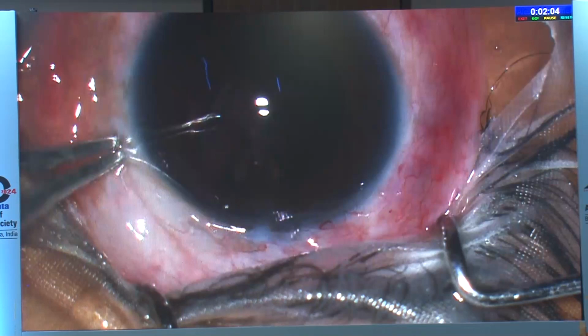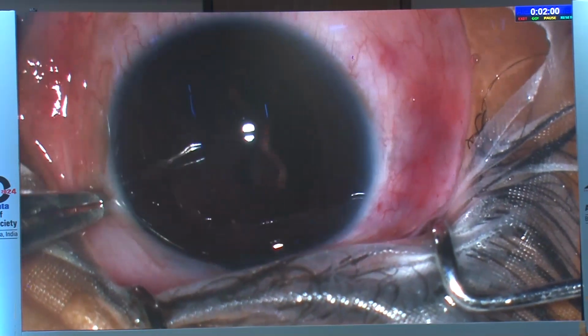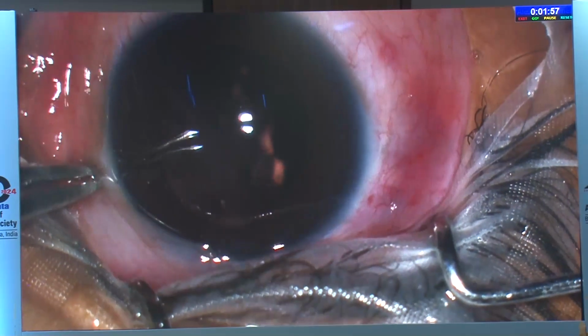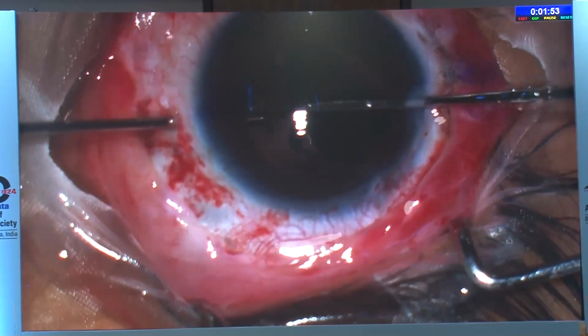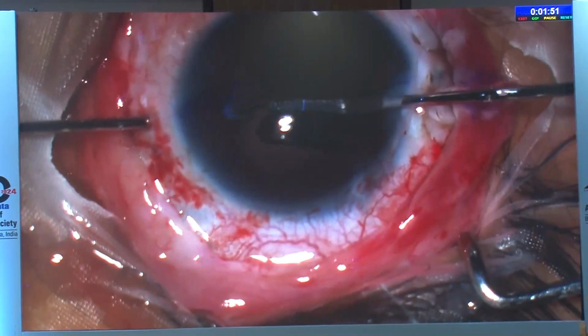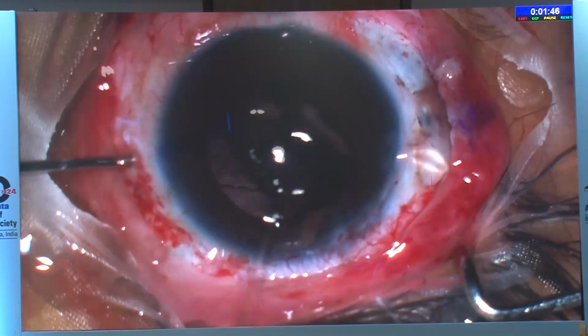So in this second case, what has happened is, you can see the T is intact. This was 2 weeks post-op. I had done this in an 8-year-old kid. So the T is intact, but again the lens has gone in. We thought that the T has folded on itself and it has gone in again.